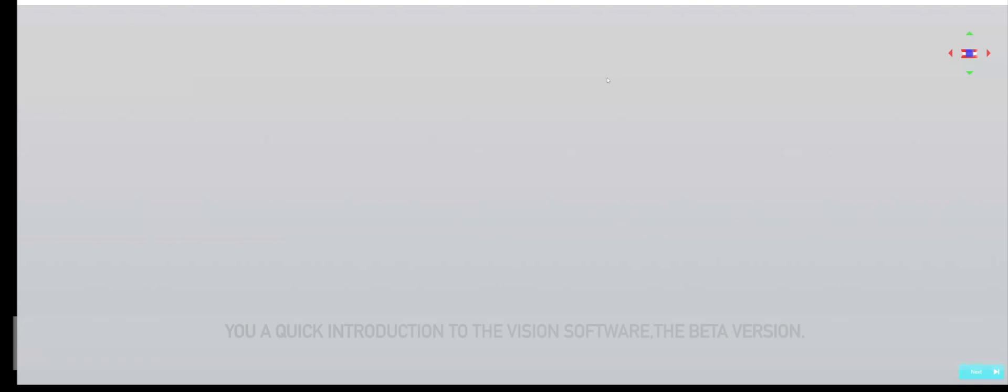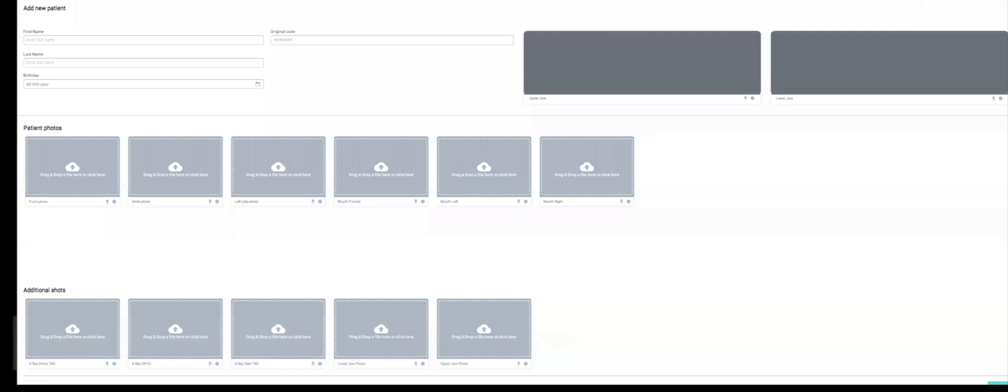Hi, I'm going to give you a quick introduction to the Vision software, the beta version. I'm going to start with the import of a new patient, for which we have a dedicated button. I'm going to click the button.